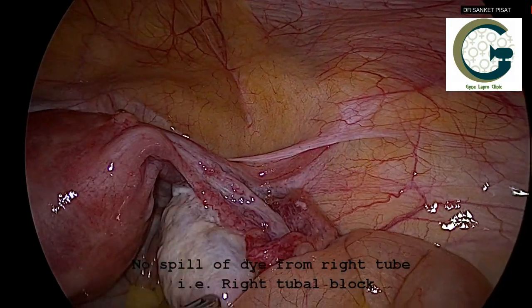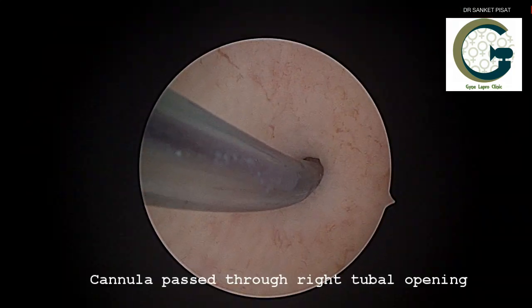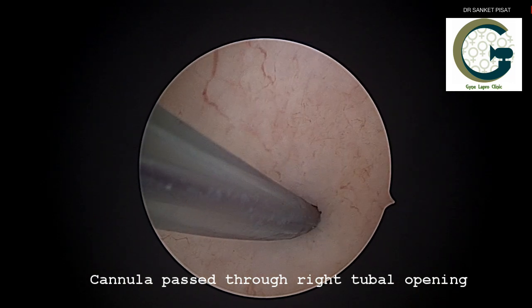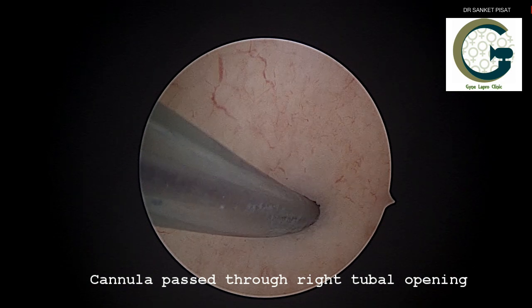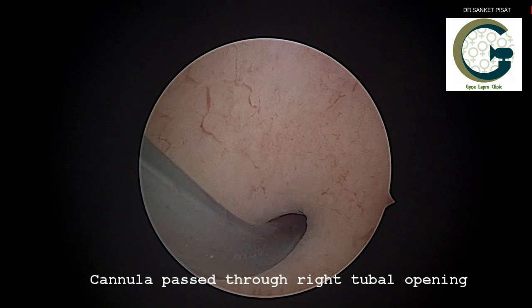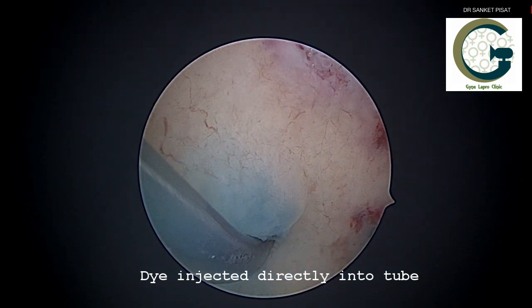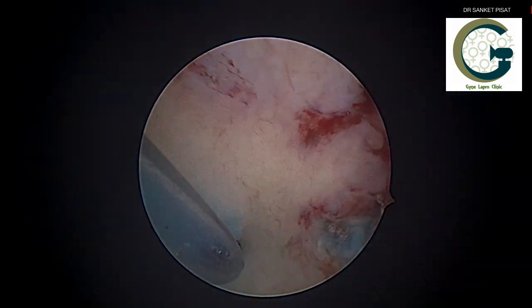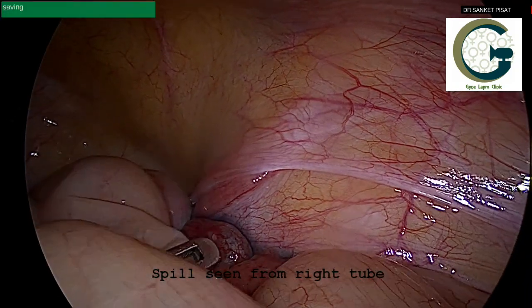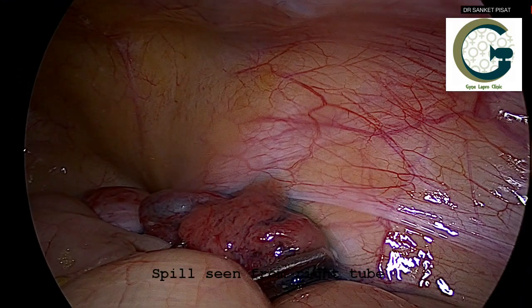Sometimes these fallopian tubes may get blocked, meaning there is no spill of dye from one or both of the tubes and the patient cannot get pregnant. The treatment for this is passing a cannula through the tubal opening — much like a stent is passed through a blocked artery in the heart — and then a dye is forcibly pushed under pressure through this opening. In most cases, the blockage can be removed simply by pushing the dye, which dislodges the blockage present inside the tube. After the dye has been pushed using this type of catheter, one can see that there is a good spill seen from the tube which was earlier blocked.